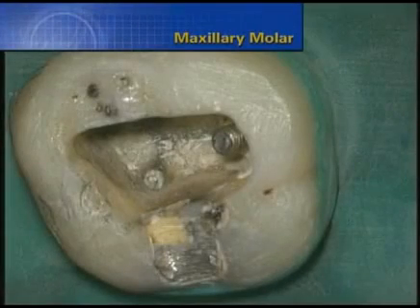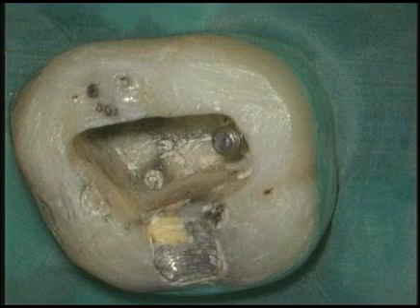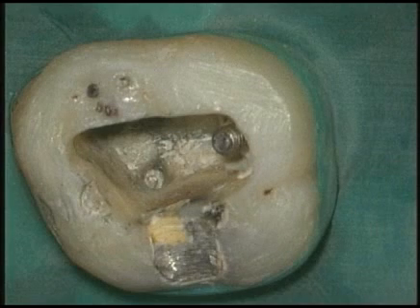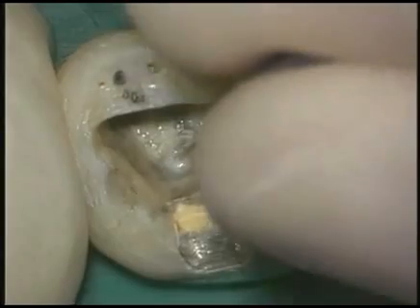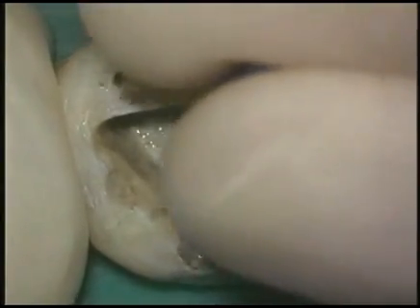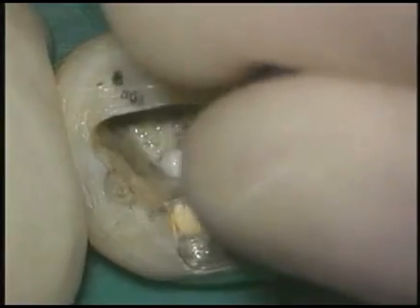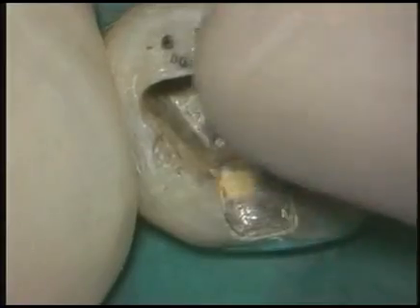Here's a maxillary molar with a sectioned silver point in the DB root. The removal procedure was performed live during the Chicago midwinter meeting. Use small hand files in the presence of a chloroform solvent to remove cement and progressively create space lateral to the obstruction. As we progressively pick in short amplitude strokes, the tin file will progress deeper into the canal. This will put more sealer into suspension.